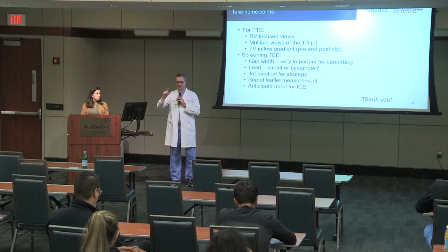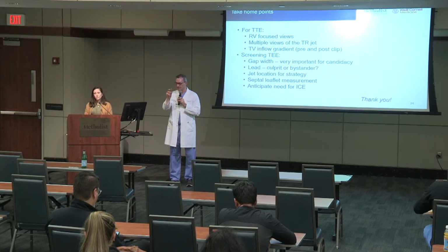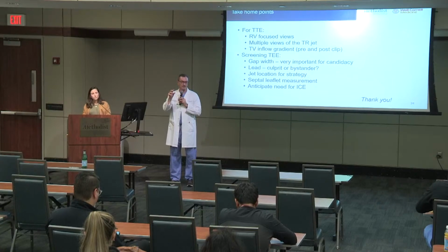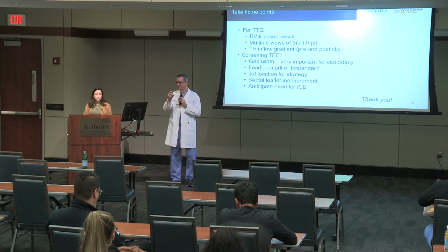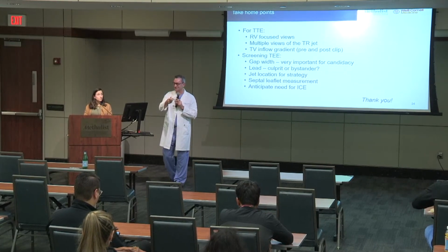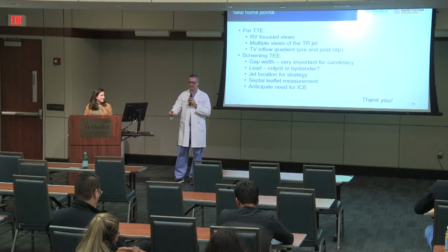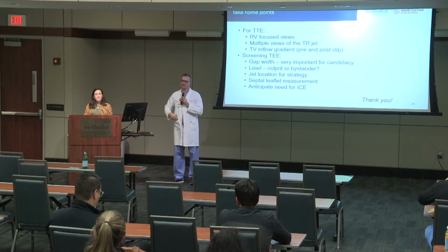Also, it's very tomographic. It's zoomed in. You don't have much depth. You only see one thing. Practically, it relies on the IC for all the coordination of it, which is frustrating because you don't actually control the image. You can advise, but you can't actually move it around. Unless you scrub with them. Yes, unless you're doing it, and then you're not doing the console. So it's always a complement.